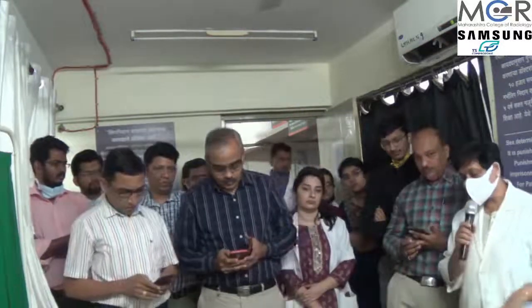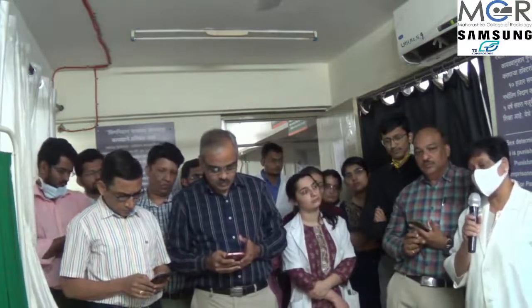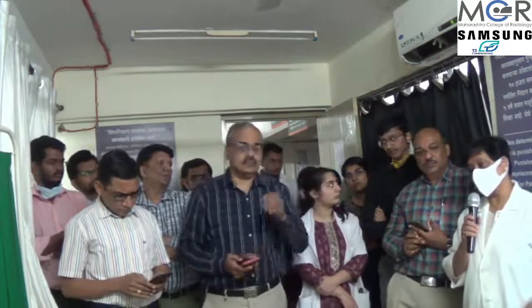The question was whether we need to do TVS in every postmenopausal woman. Yes, I would say the answer is yes. Today, no female pelvic examination is complete without a TAS and TVS.